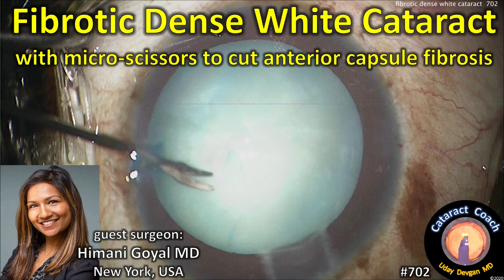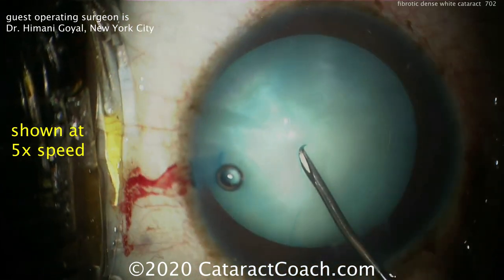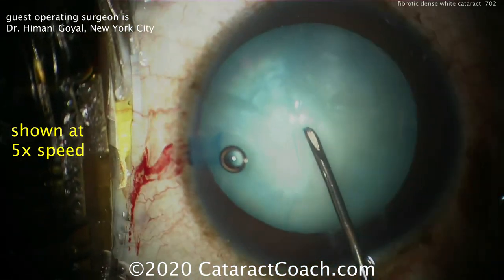CataractCoach.com presents: Fibrotic Dense White Cataract — Using Micro Scissors to Cut the Anterior Capsule. Our guest surgeon is Dr. Himani Goyal from New York City. The video is shown at 5 times normal speed.